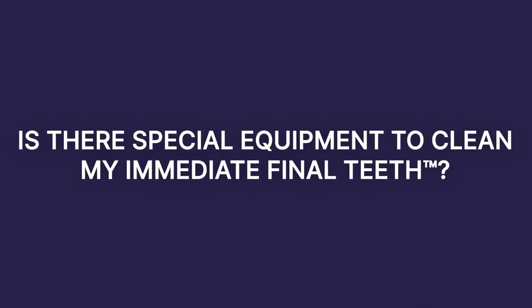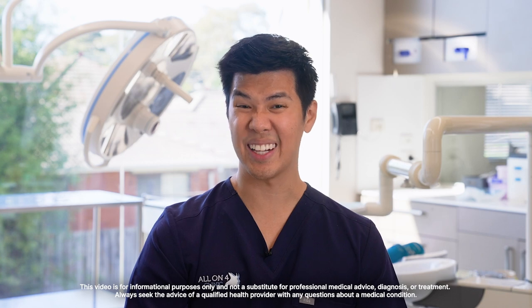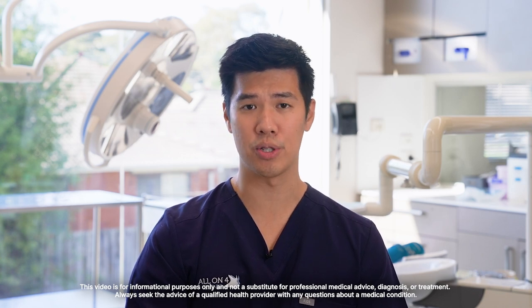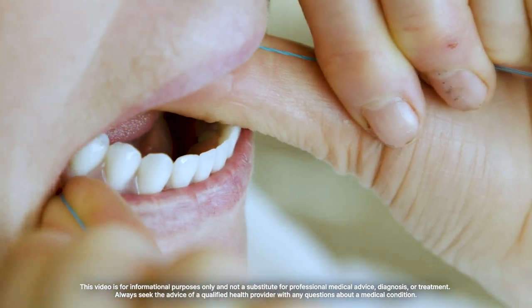We recommend using a soft toothbrush to brush your immediate final teeth. We do not recommend using an electric toothbrush as that can rattle around too much. We also recommend using a product called x-floss to clean beneath the teeth and between the implants. We will give you a pack upon your three-week review and you're welcome to buy these from us or online.